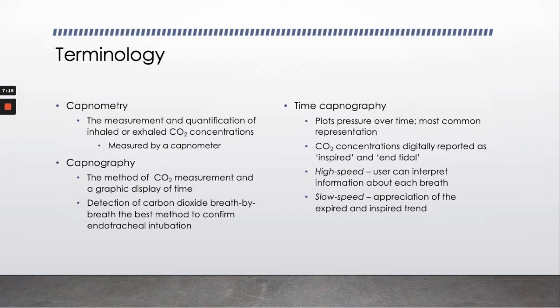It could turn color even with an esophageal intubation, so it's not always the best indicator. But if you're not using a color change indicator and you have adequate CO2 on your monitor and you see a good waveform, then you know that you're in the right place.